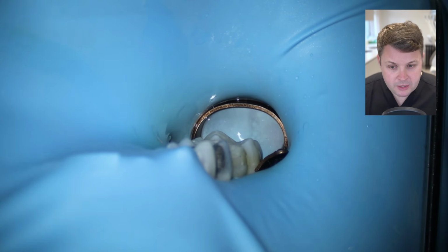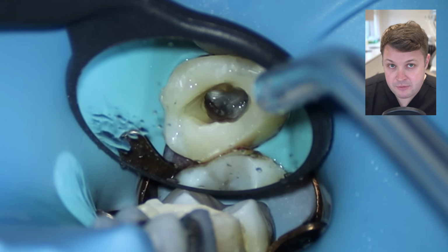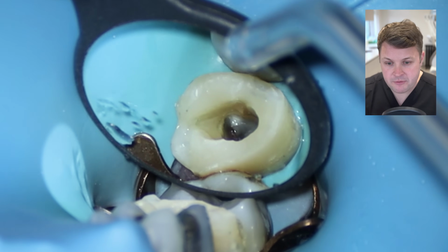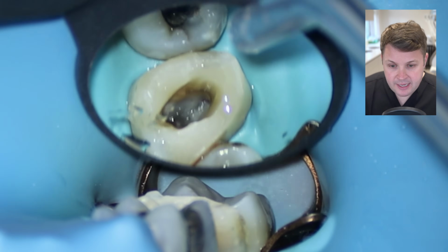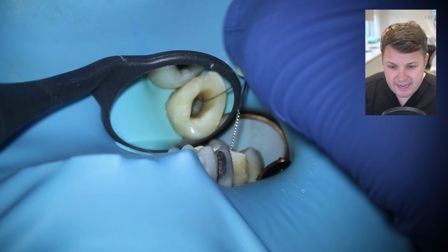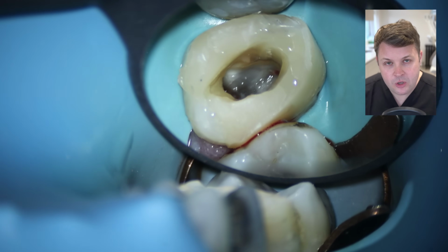So straight away when we look at this access cavity, it doesn't look conventional. I momentarily forget here that this tooth is an upper right tooth, and when I look at this, it looks like it's flipped around. In fact the MB actually looks like the palatal because it looks like it's by itself. I place my size 10 K file into the disto-buccal, and I just feel like I can't really get that far. And again, it looks like this is the palatal, if you know what I mean.